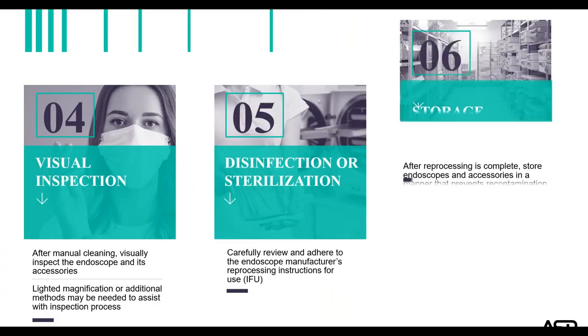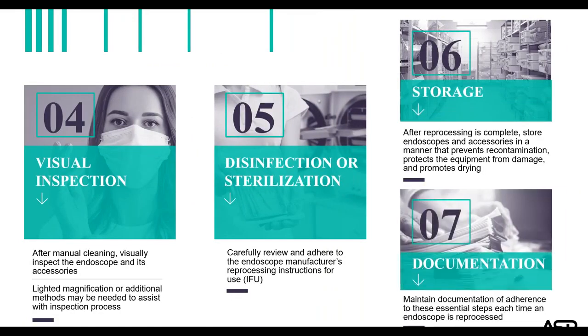After manual cleaning, visually inspect the scope and accessories for cleanliness, missing parts, lens clarity, integrity, moisture, and function. Most facilities, in addition, are using some type of cleaning verification test after the cleaning. All of these steps should take place prior to either high-level disinfecting or sterilizing the device.